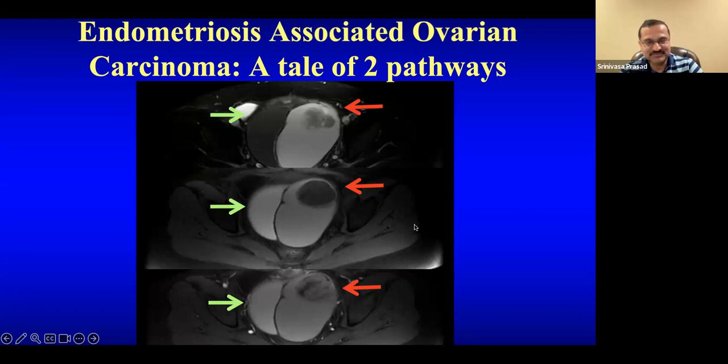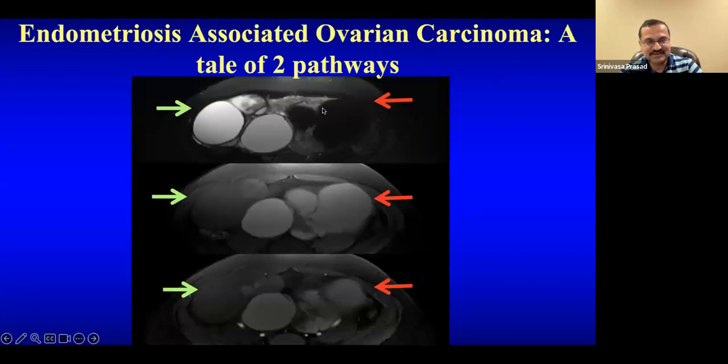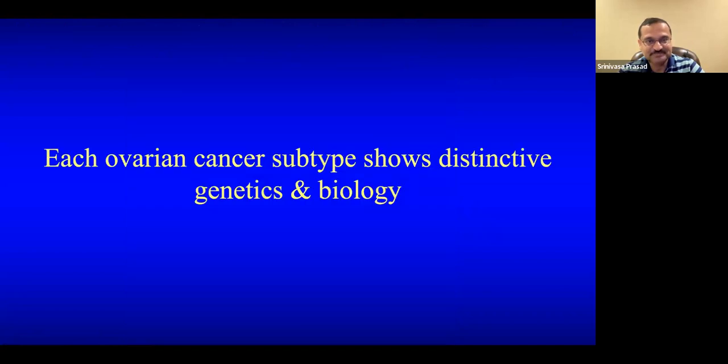So interesting endometriosis-associated cancers. And another example of a tumor with background cystadenofibroma as opposed to background endometriosis in the same patient, two different pathological contexts of different backgrounds of abnormalities.